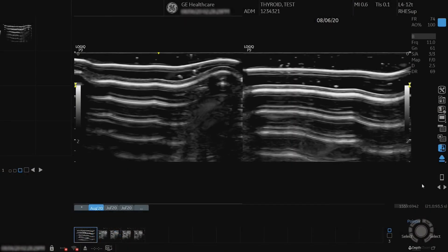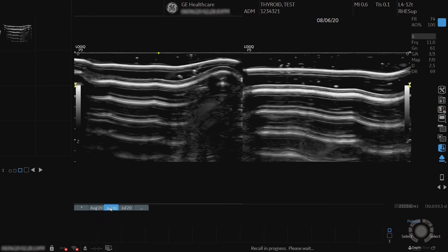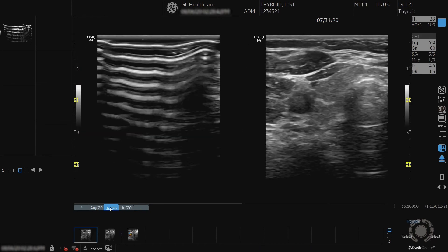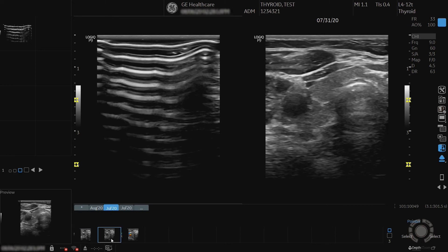All previous exams will be displayed next to the current exam. Select the desired exam by date. Select the previous image from the clipboard that you would like to compare. Scan the anatomy of interest.